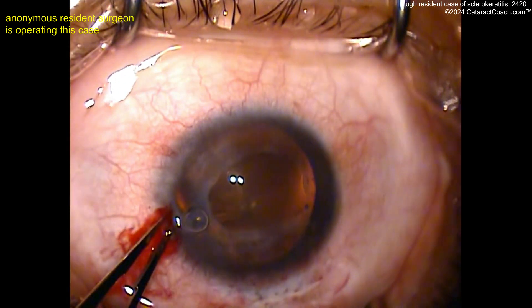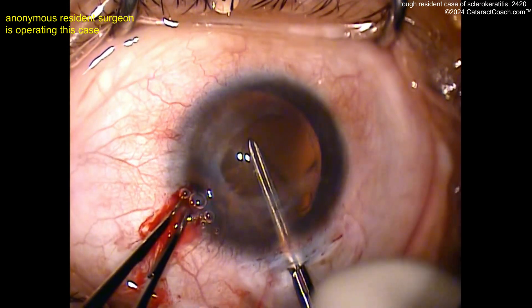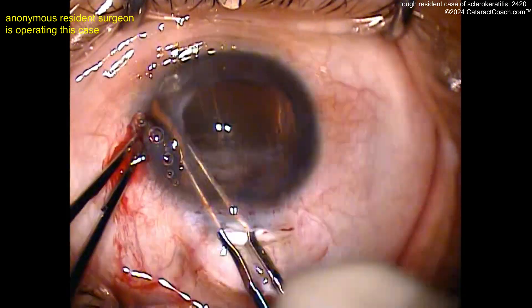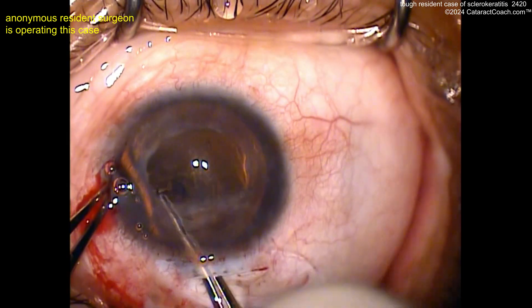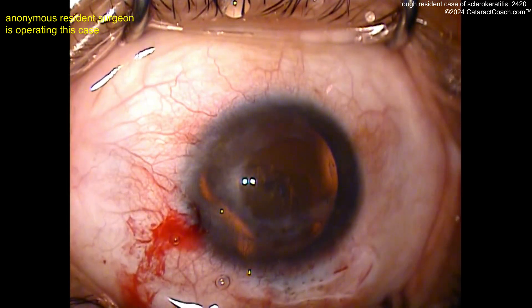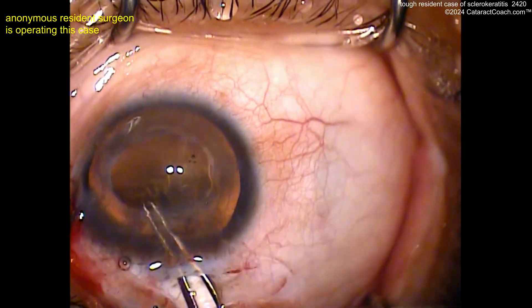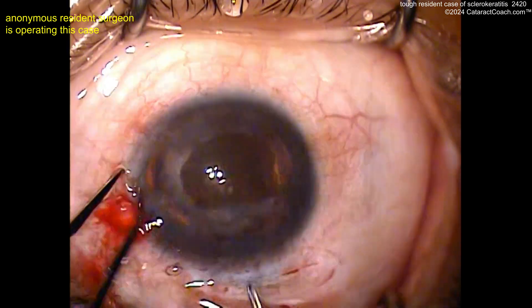Another key to using a scleral tunnel: remember, it's a little bit different angle of approach compared to a corneal incision. If you make that corneal or limbal incision, you're in a slightly different position. On the scleral tunnel, you're a little bit further back from the limbus, obviously, and as a result the instruments are a little flatter — so it takes a little getting used to. But here it looks like a pretty good rhexis. And luckily, it's not too dense of a cataract — looks like a pretty strong red reflex there.